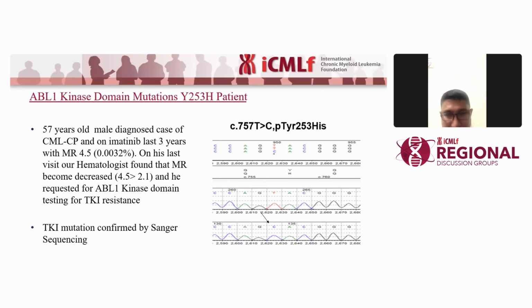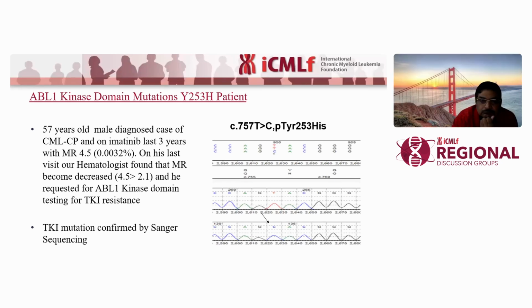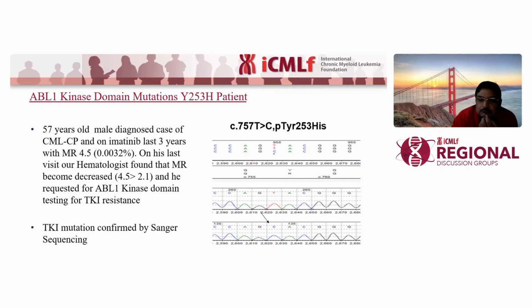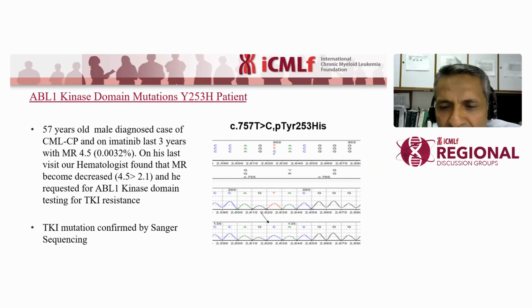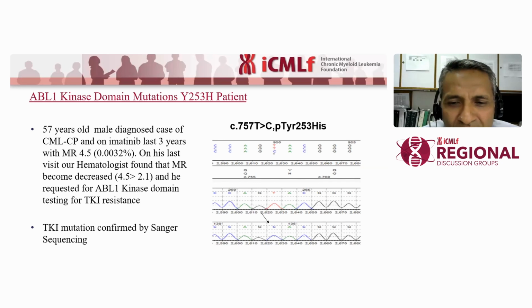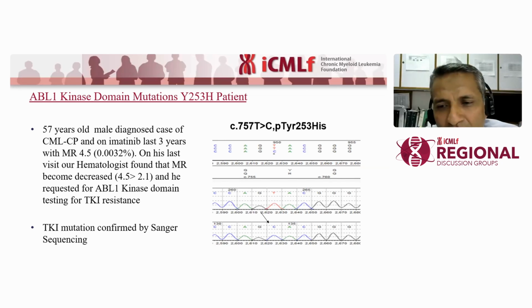In Sanger, your query is very right, and we are also challenged by that sometimes, as we discussed in our previous lecture by Dr. Ali, that RNA is very sensitive to stabilize.